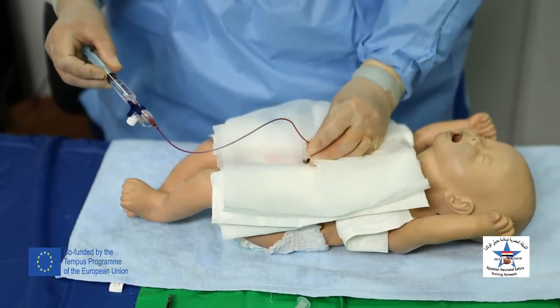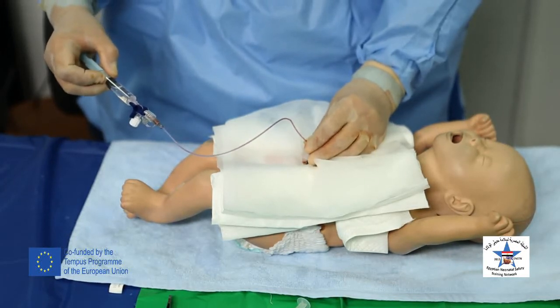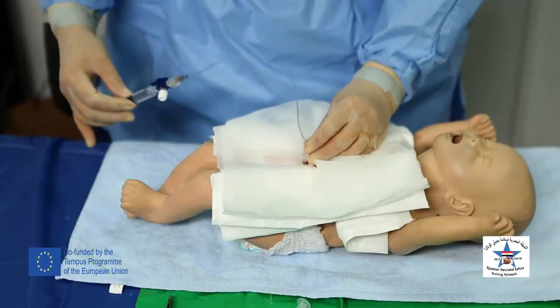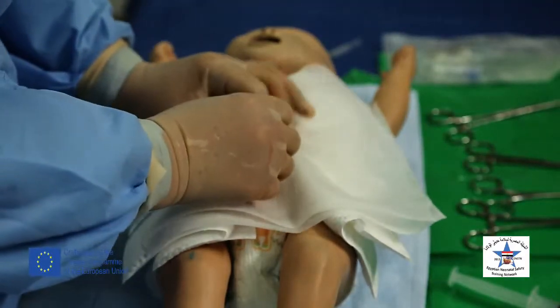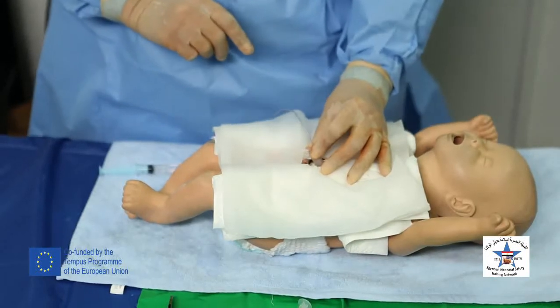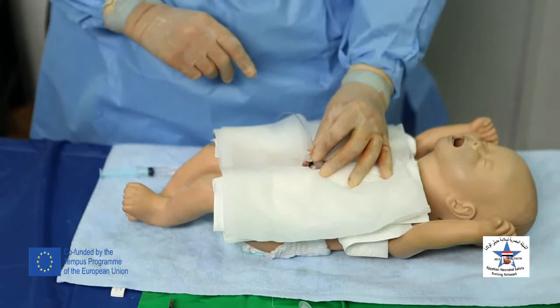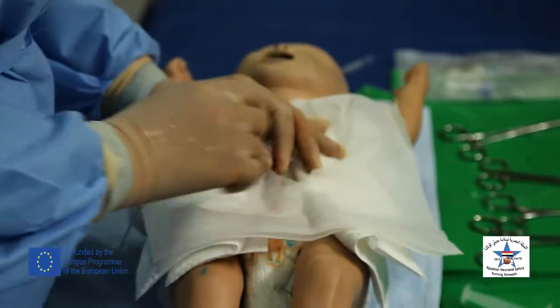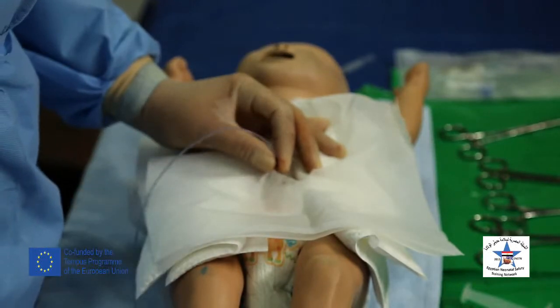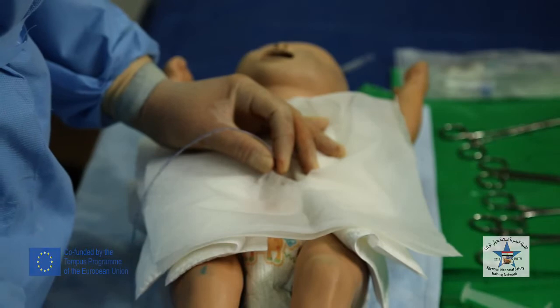And push the heparinized saline through the catheter. The proper level of the catheter should be above the right side of the diaphragm or the right copula of the diaphragm. The predetermined length of the catheter is determined from graphs of the shoulder umbilical length or the weight of the baby.